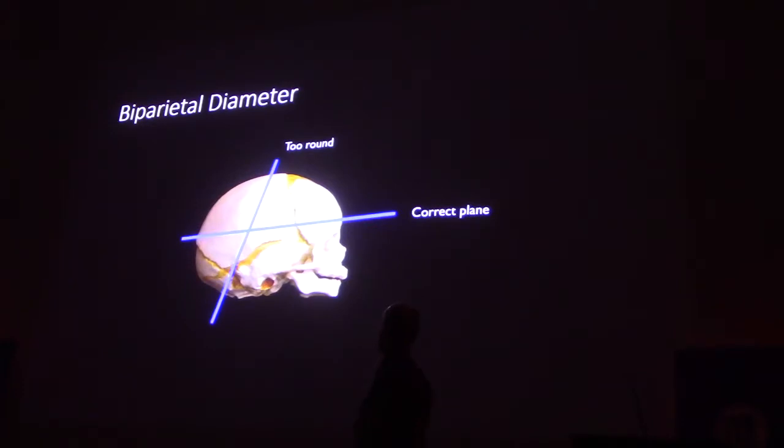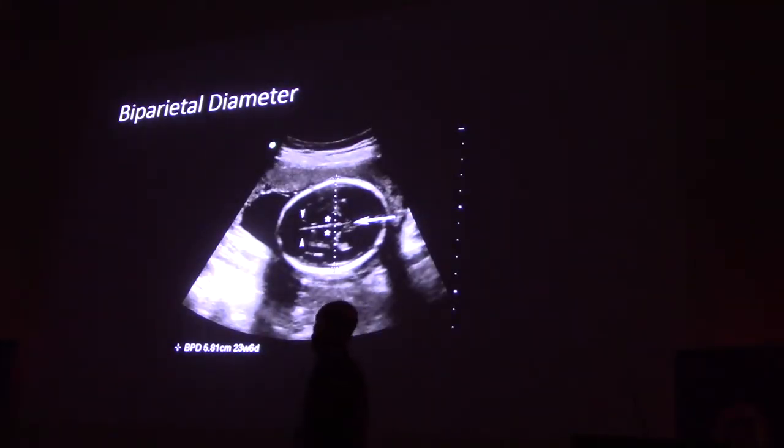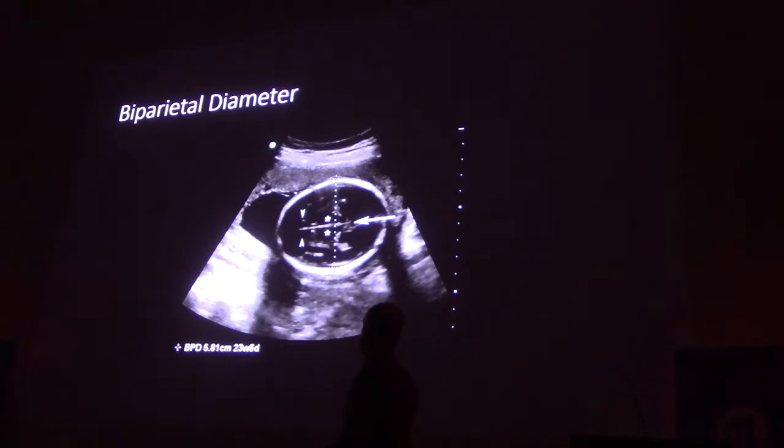So just for your own reference, this is the slice we want. We're basically just going to try to get a plane, basically taking the top of the calvarium off, if you can. So appropriate measurements are outer calvarium wall of the near wall, inner calvarium wall of the far wall. You want the falx transversely across at the level of the thalamus and the third ventricle. I never identify the thalamus and the third ventricle, but in general, if you get a sort of symmetric view like this with the falx in the middle, it's generally good enough.